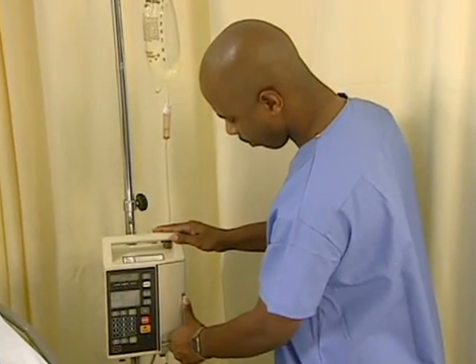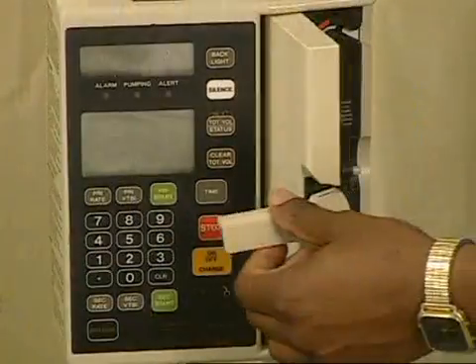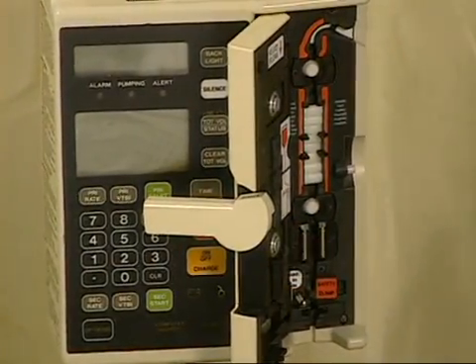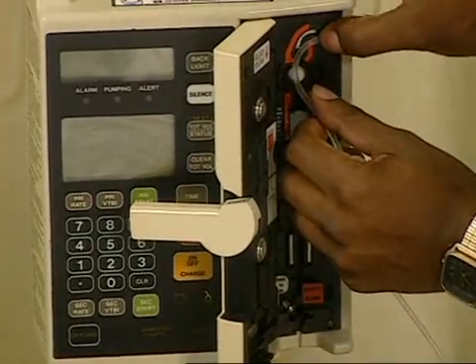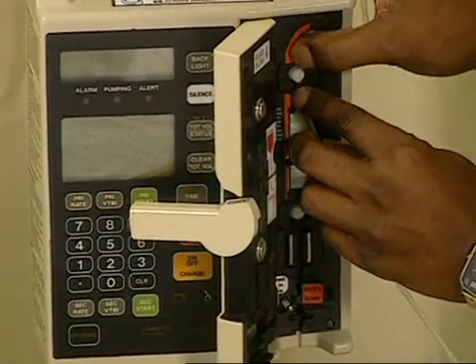The flow is controlled by the pump, which physically milks or compresses the tubing to propel fluid through the line. Open the door to the infusion pump and insert the IV tubing.